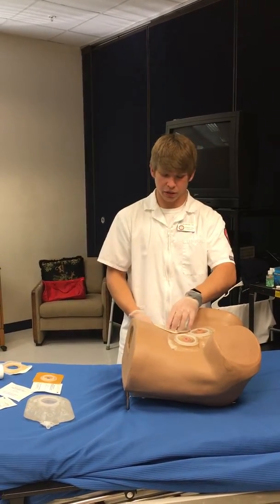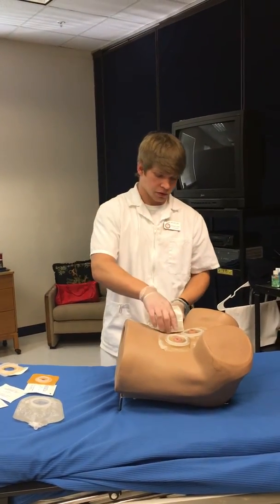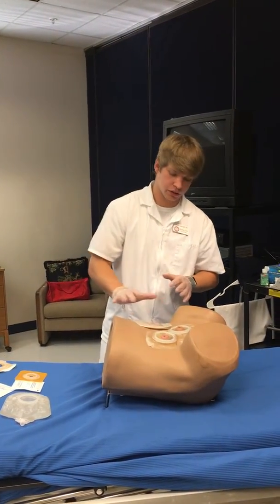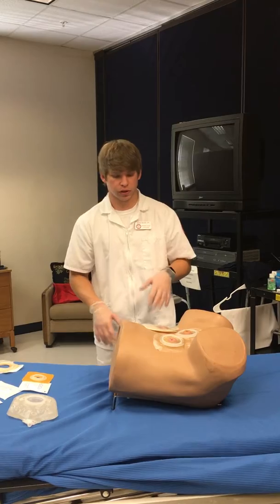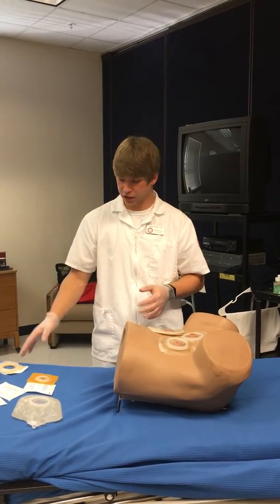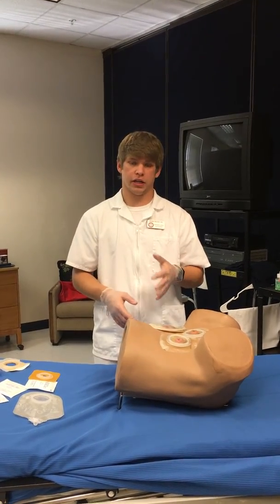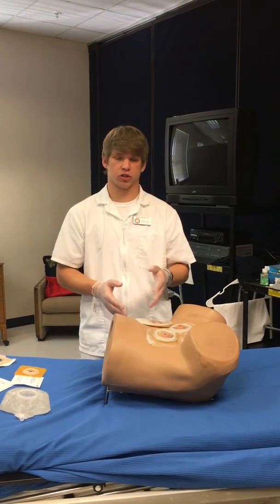Ask the patient if they're feeling any pain, tenderness, or throbbing. Once you're done, check one more time to make sure everything's good to go. Then go back and document how much feces and waste was in the old stoma bag, document how the patient tolerated it, any drainage, and what the stoma looked like.